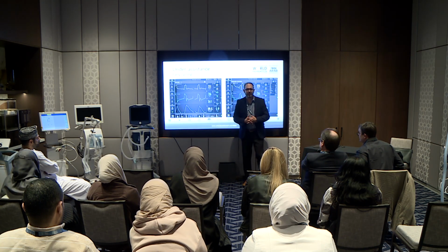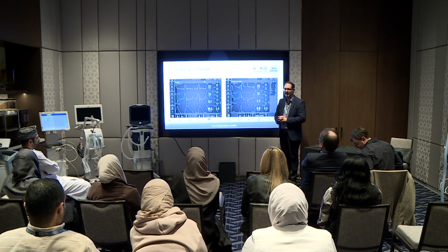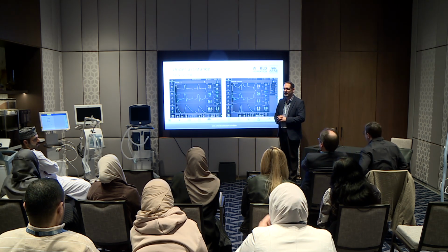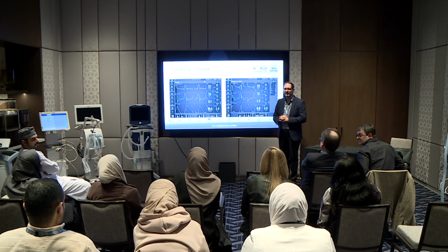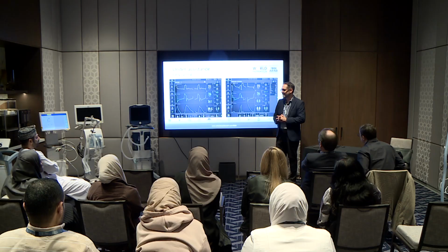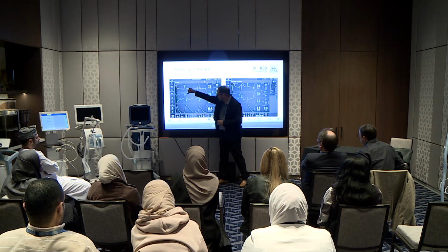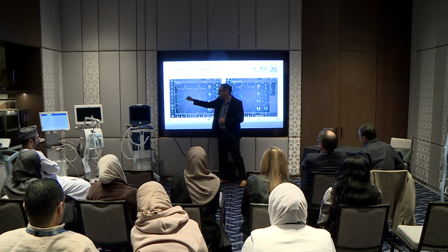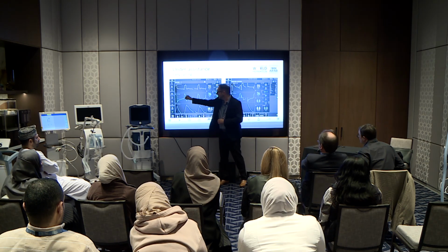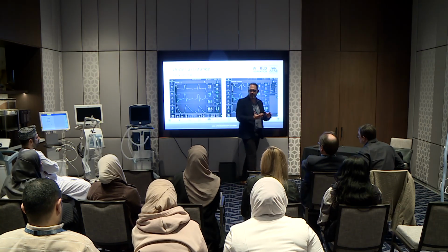What would you do with that number? Would you increase it or decrease it? We need to reduce. Decrease it, yes. We need to reduce it, because this is my peak. It's cycling off at 60%. It's too short. You can see the effort still continues. I have to extend it, which means I decrease this down to allow pressurization to occur while the patient is still inspiring, okay?